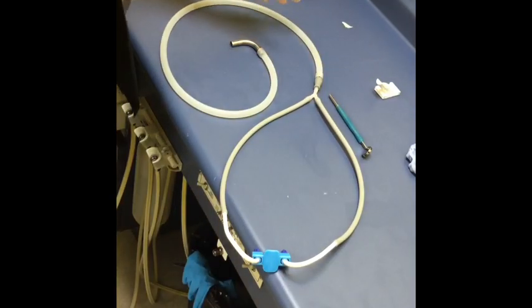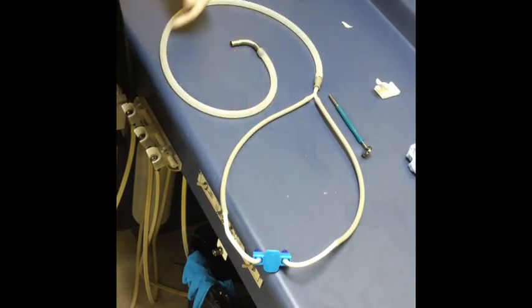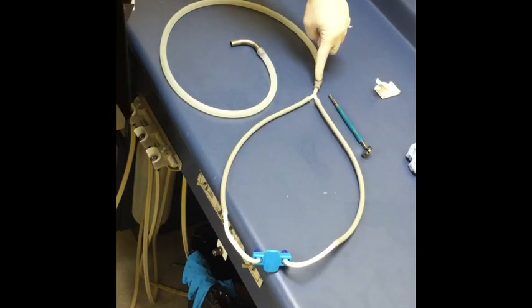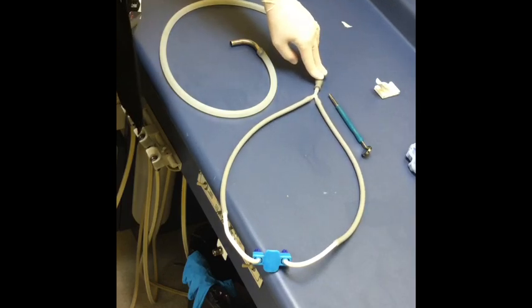This is my whole setup that I use in hygiene. The parts you see here - this is the Kona tube kit, all the way up to here. This is a SC-HVE adapter. That's not my product; you have to buy that from Practicon for about 15 bucks.